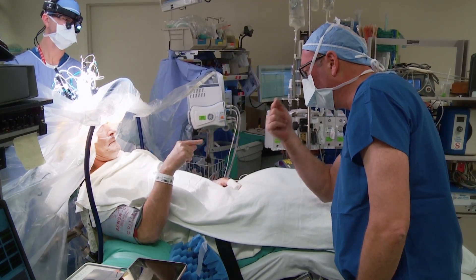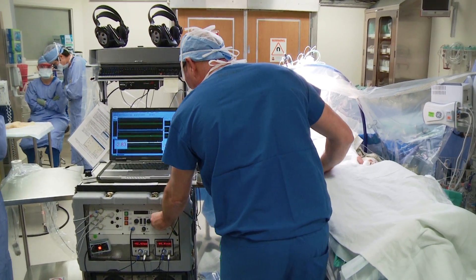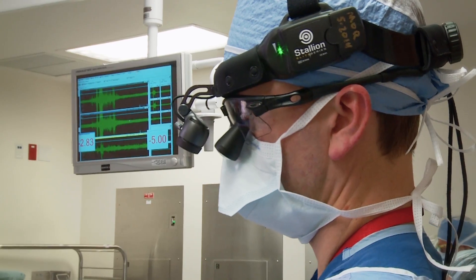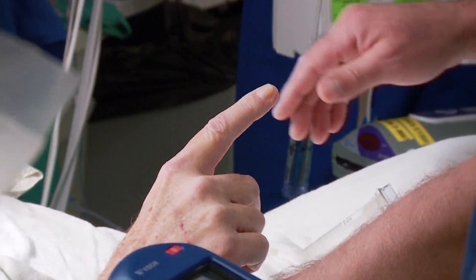There will be surgical dressings on your head where the incisions for DBS placement were made. You may notice a small, temporarily raised area under your scalp behind your ear where the wires are stored.